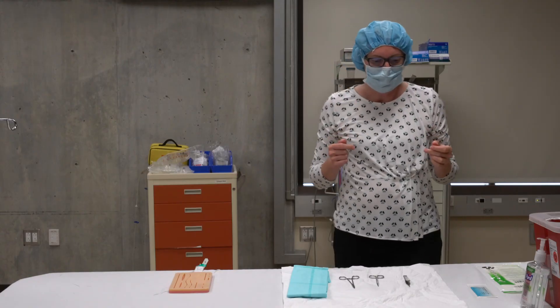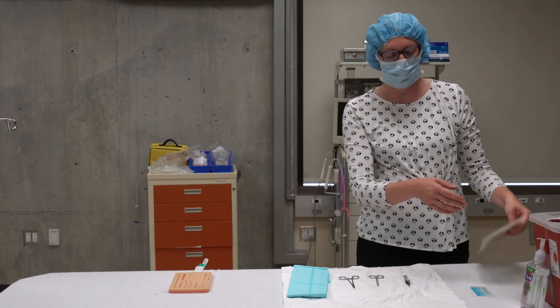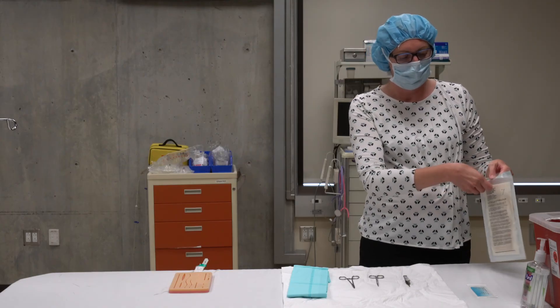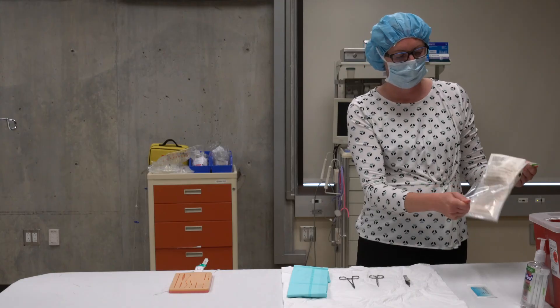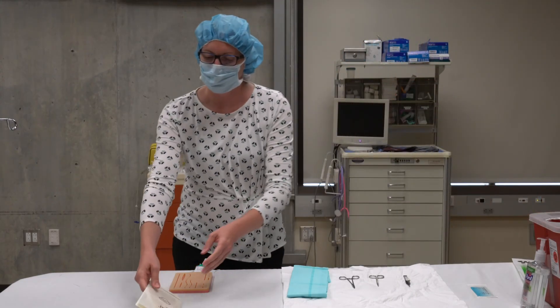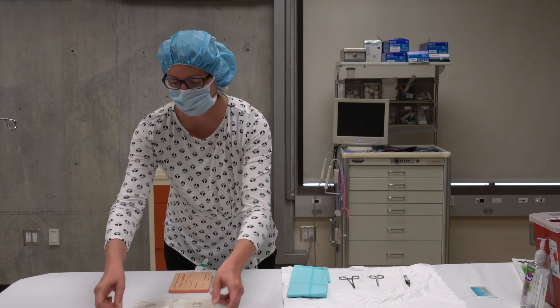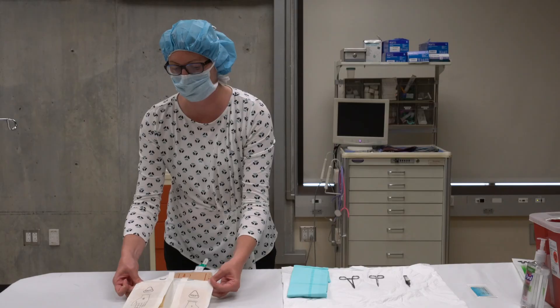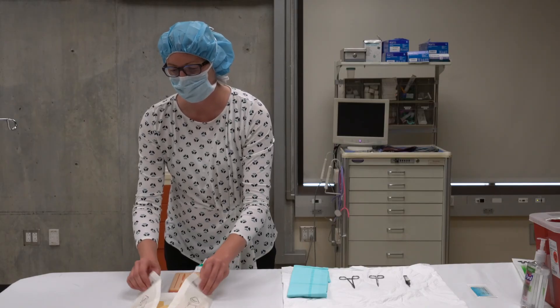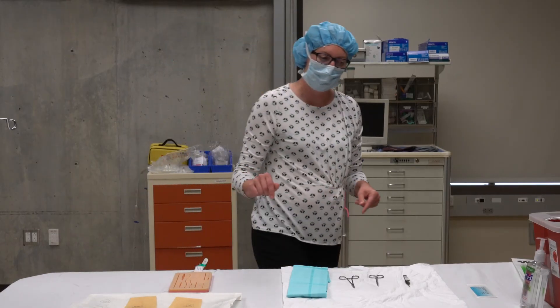Before I scrub my hands with the sterile scrub, I'm going to do two things. I'm going to open up my gloves so that I can put them on later. I'll open my gloves on a flat surface, touching only the paper — I don't want to touch the gloves with my dirty hands.